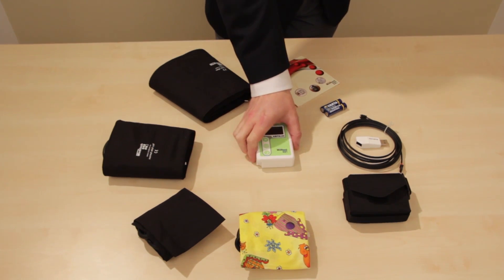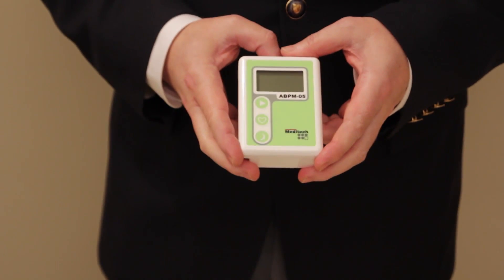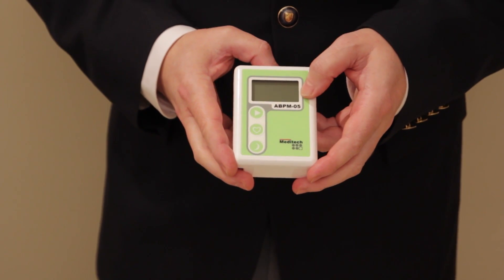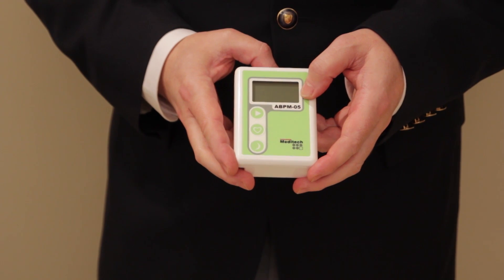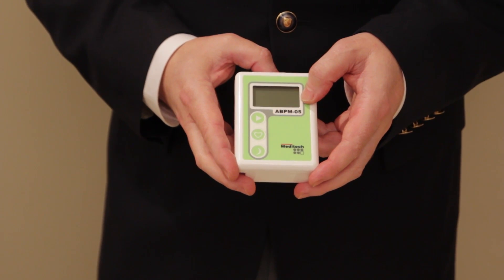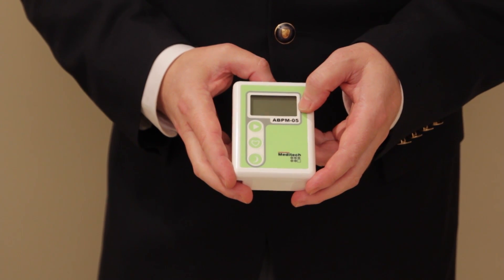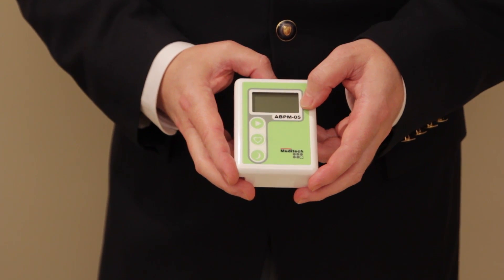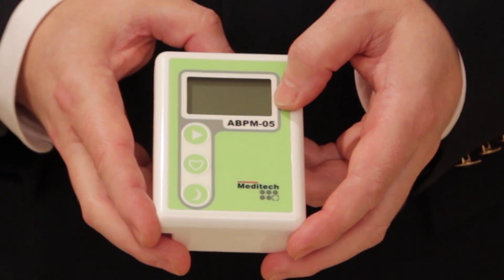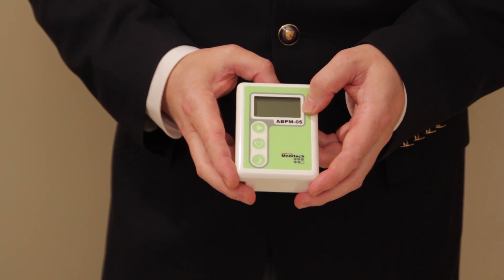The device itself is small and lightweight. It has a relatively large size LCD which will show you everything that you need to know during the operation of the device: programming information, computer connection information, the individual measurement results, and if there are any errors, it will also show error codes.